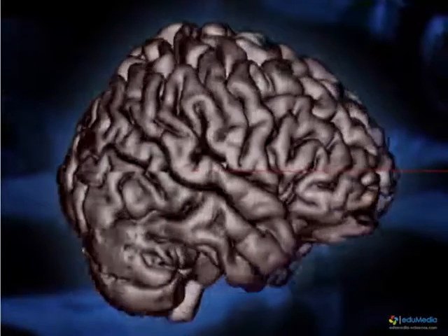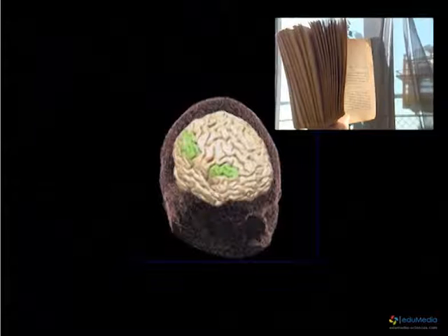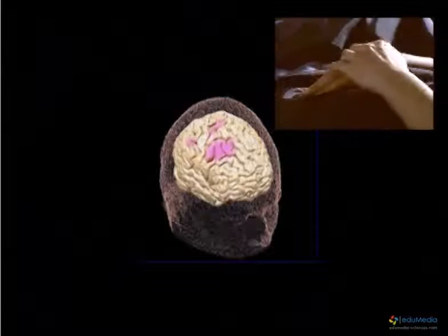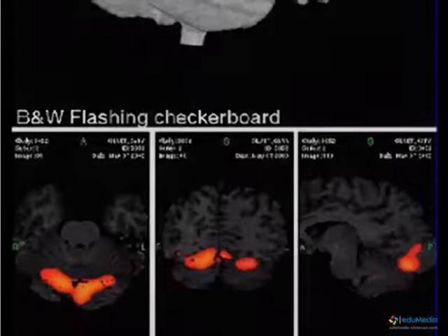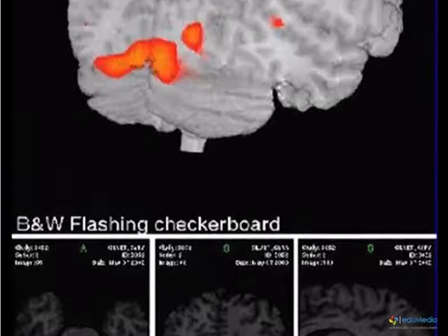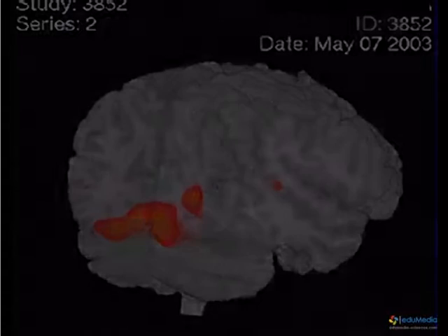The end result is to be able to follow the activity of a region of the brain using real-time observations of variations in the oxygenation of the blood, more specifically of hemoglobin. Hemoglobin transports and delivers dioxygen to the tissues. When hemoglobin releases dioxygen to the tissues, we say that oxyhemoglobin is transformed into deoxyhemoglobin. Deoxyhemoglobin reacts to the magnetic field and produces a signal that can be seen in the images. Thus, the areas of the brain that are involved in a specific activity can be identified and possible anomalies detected.